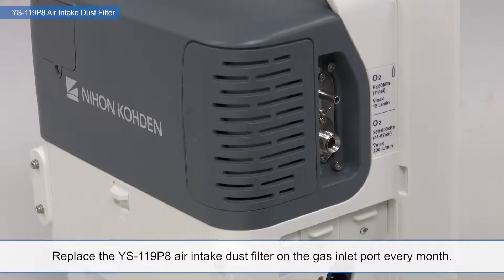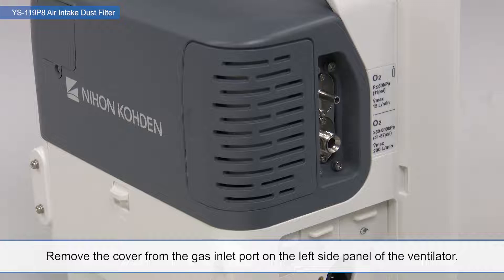Replace the YS-119-P8 air intake dust filter on the gas inlet port every month. Remove the cover from the gas inlet port on the left side of the panel of the ventilator.